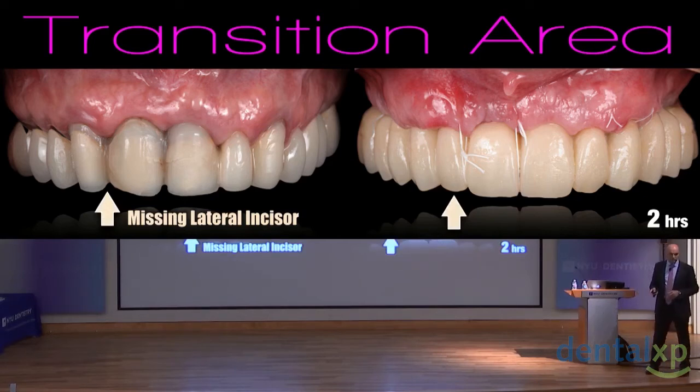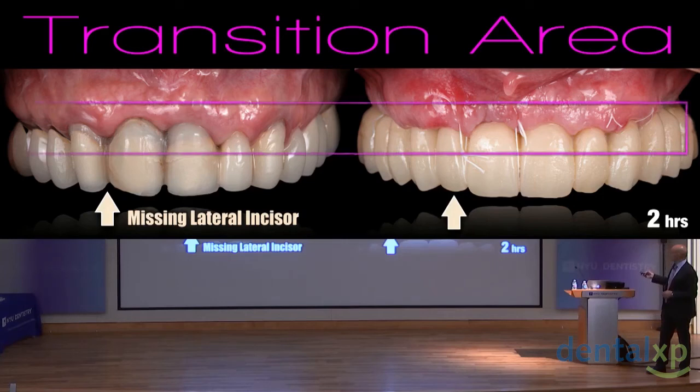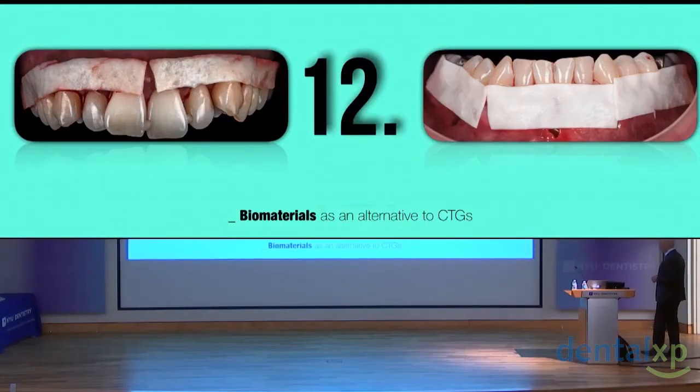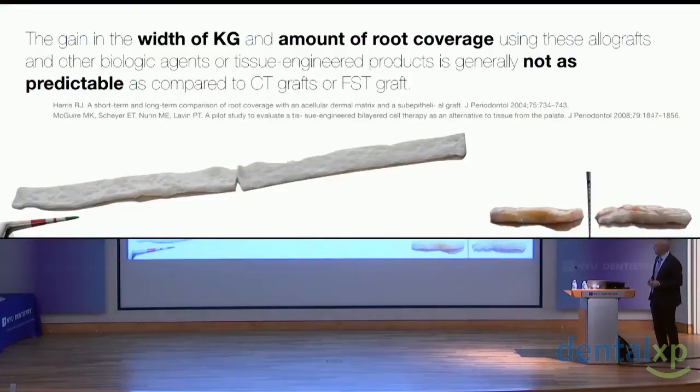But the stability of the results depends on the graft you placed under the flap, in the long term, of course, not in the short term, okay? This is before, and this is the transition area after. So I can use biomaterials. Another question, as an option: yes, of course, but what I observed is the same as the literature tells us. The gain in the width of keratinized tissue and the amount of root coverage is not as predictable.